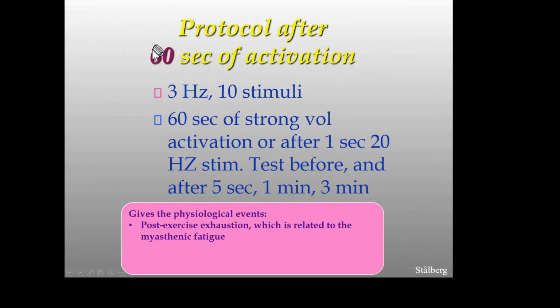Then we have the long-term protocol that gives the post-exercise exhaustion, and that is more related to the myasthenic fatigue, and that is also more often positive in terms of giving a diagnosis of myasthenia than just rest or a shorter degree of activation.